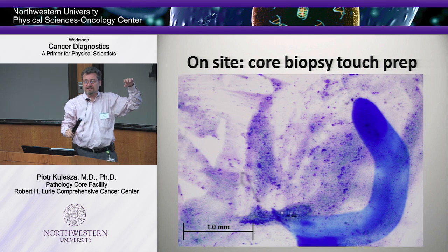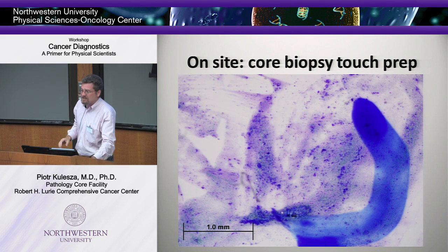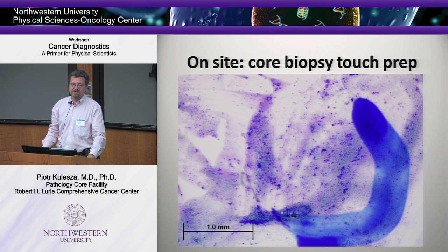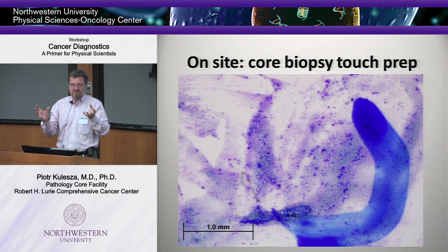The smears are basically the serum that's dragging along and maybe tumoral material. This is a very low power view, a 2x magnification view. This is the kind of cellular pattern that I see on the slide. So this is where my job as a pathologist begins, trying to understand what this lesion is.